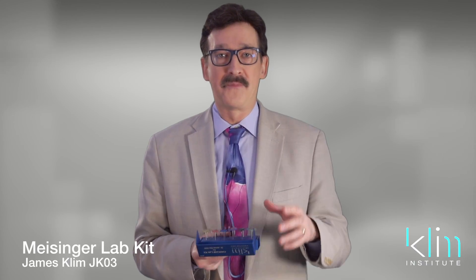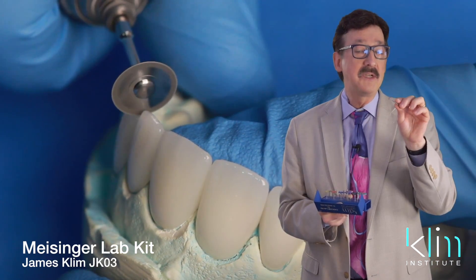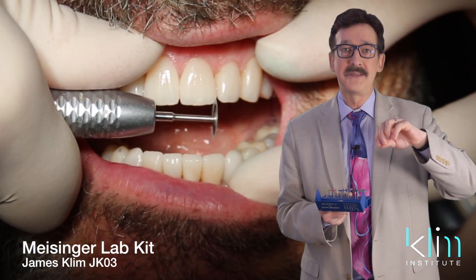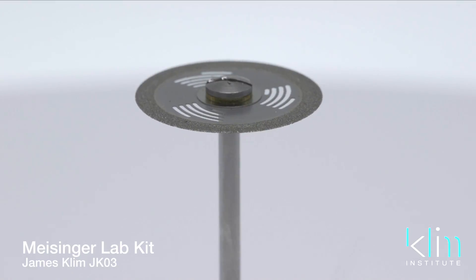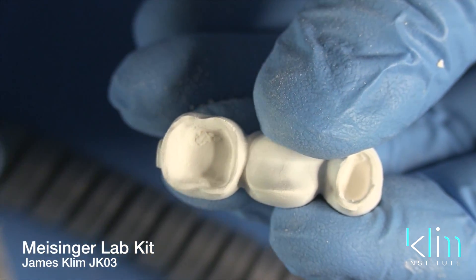Thank you, Meisinger, for providing this on our kit — it has come in so handy. A few more shapers and polishers on the kit are the shaping wheels. We have a small shaping wheel used for recontouring the incisal edges or opening up embrasures for aesthetics — we can use this in the mouth or prior to placing our ceramics. We also have a larger centered diamond wheel, which is for cutting off sprues and shaping.